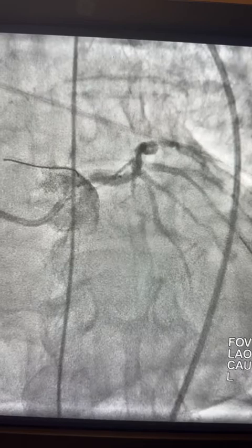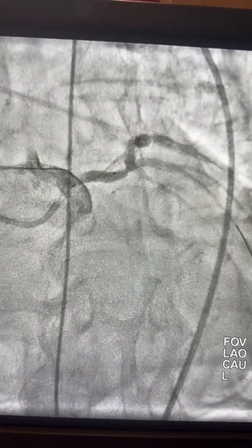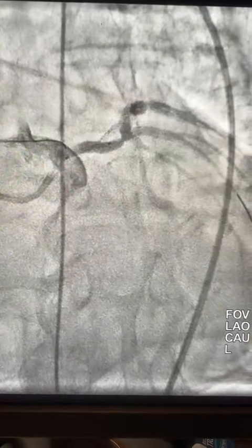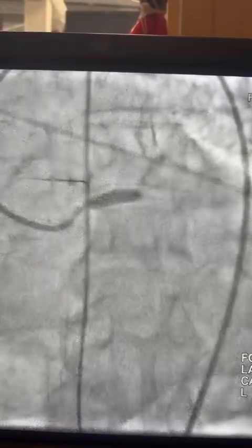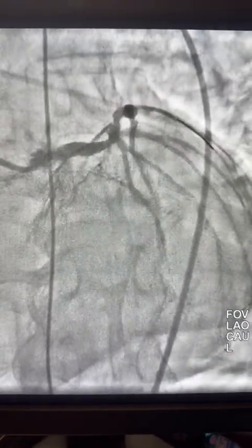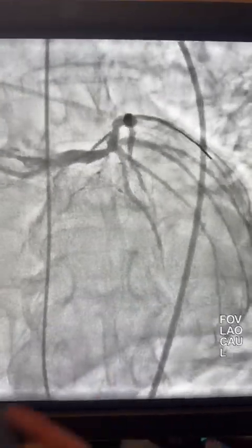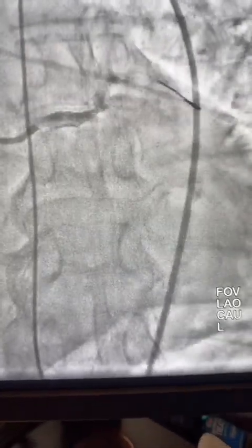Here is the placement. Looks like a nice position. And then, of course, deploying the stent at high pressure. Here is the angiogram — there is a nice dye reflex, and there is no damping or ventricularziation of the pressure.